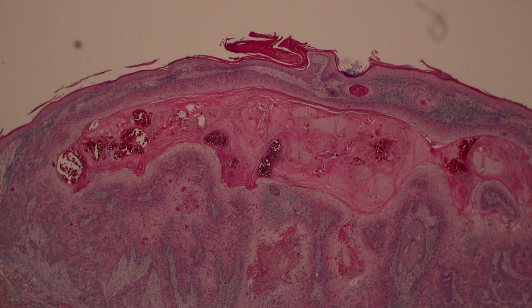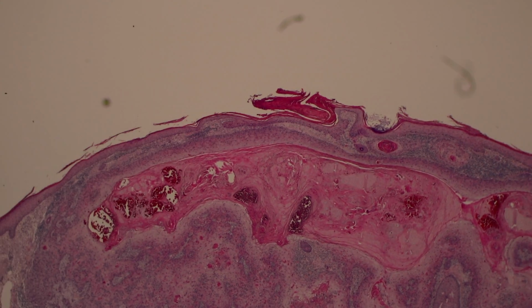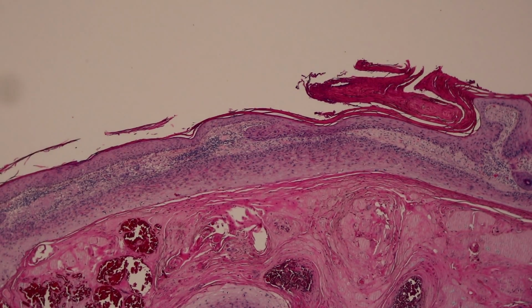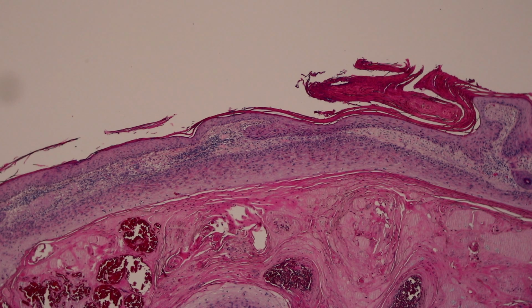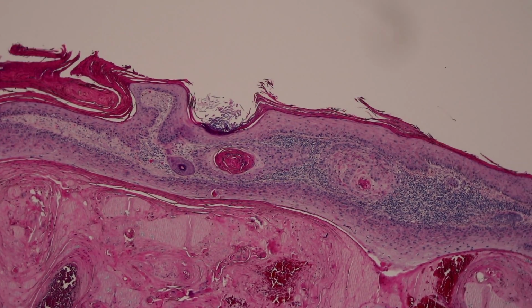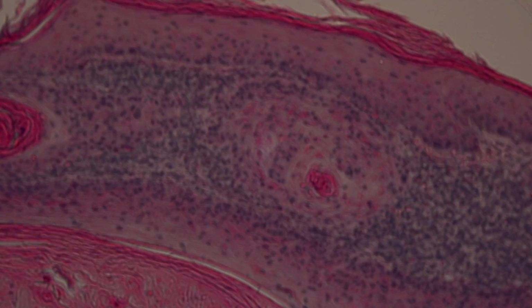And then here's a nice example where you can have a couple of things. This is one area where you have a bunch of keratin and it's making a cystic portion of the lesion. And so squames can sometimes mimic cysts. Now, if you're lucky, you'll see atypia in the cyst wall, and a lot of parakeratosis in the cyst lumen, but sometimes you won't. So if I see a big cyst that's real close to the skin surface, particularly in the very sun-damaged extremities, like on the dorsal hand or forearm, I tend to be cautious in that setting and worry that maybe I'm getting either the top of a cystic squame or a keratoacanthoma, which we'll talk about in a separate video.